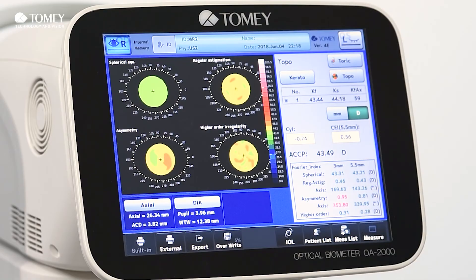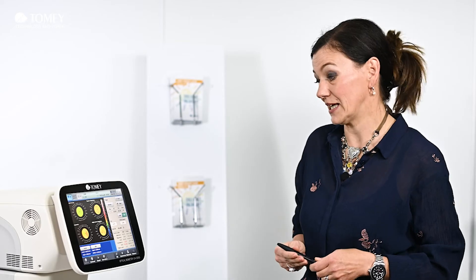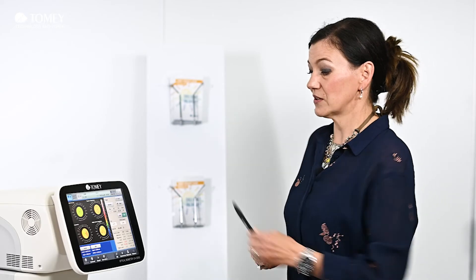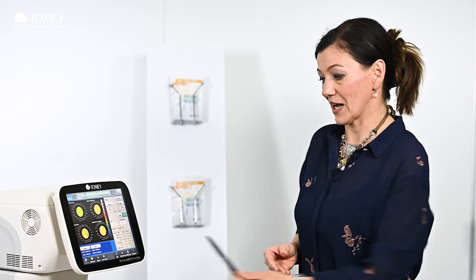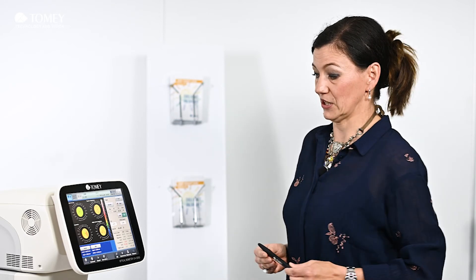The values are displayed in different colors — like a traffic light: green is for normal values and red indicates abnormal values.